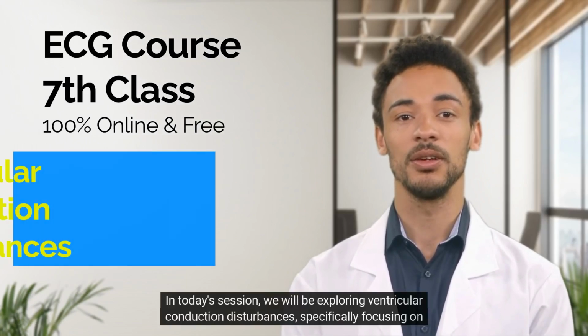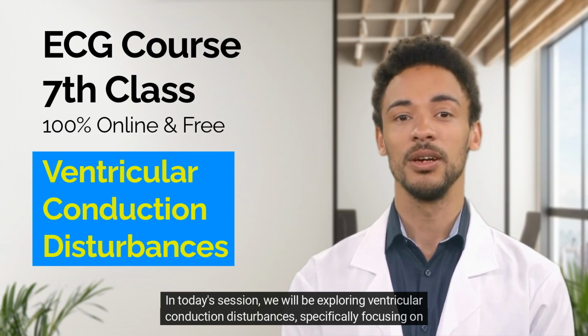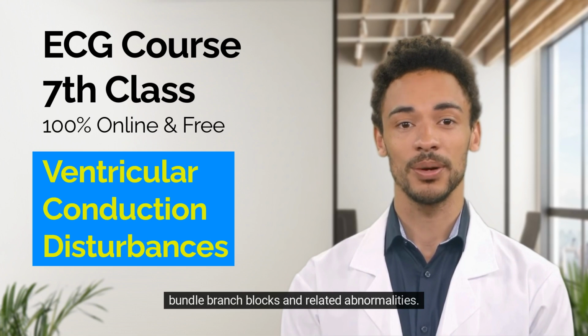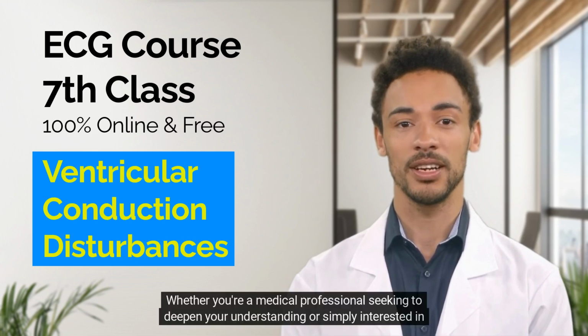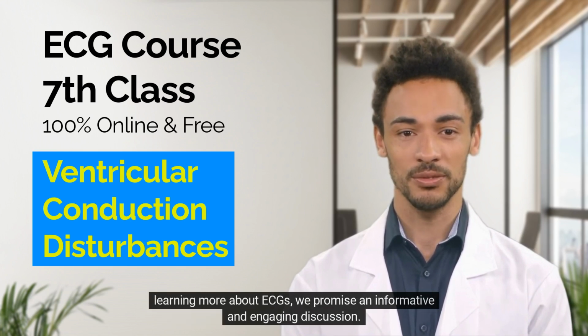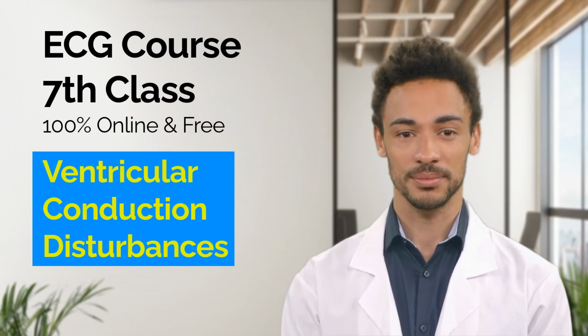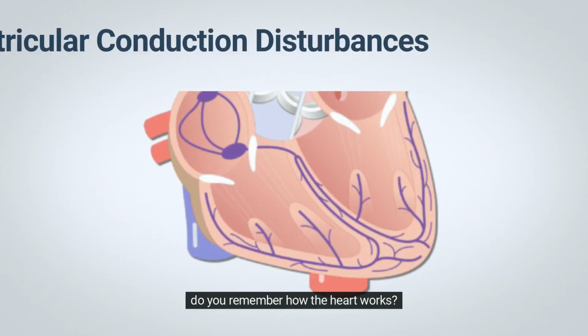In today's session, we will be exploring ventricular conduction disturbances, specifically focusing on bundle branch blocks and related abnormalities. Whether you're a medical professional seeking to deepen your understanding, or simply interested in learning more about ECGs, we promise an informative and engaging discussion. So, let's get started. Do you remember how the heart works?